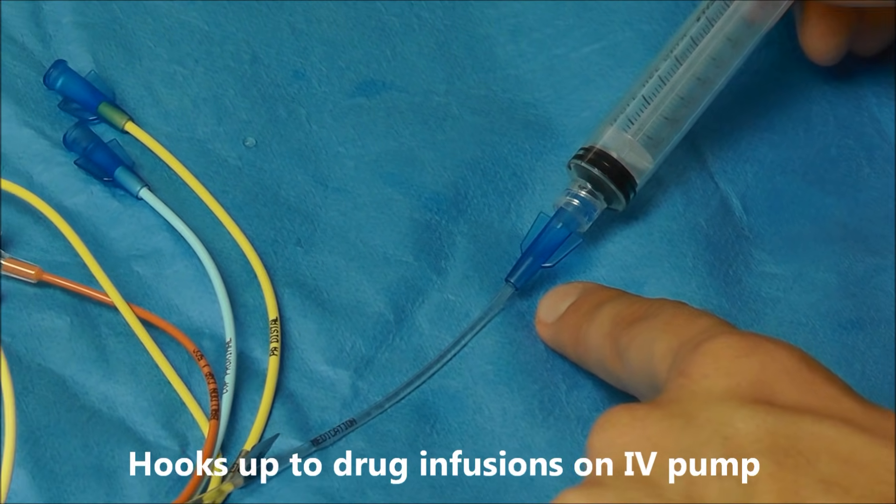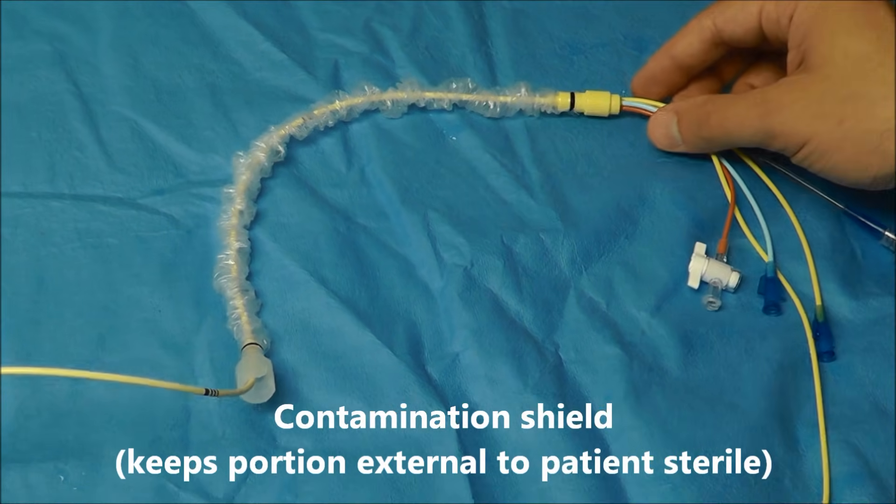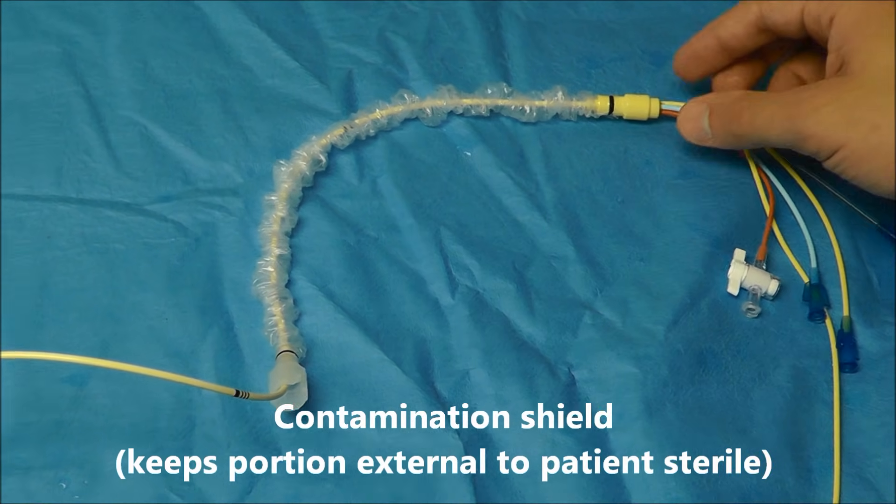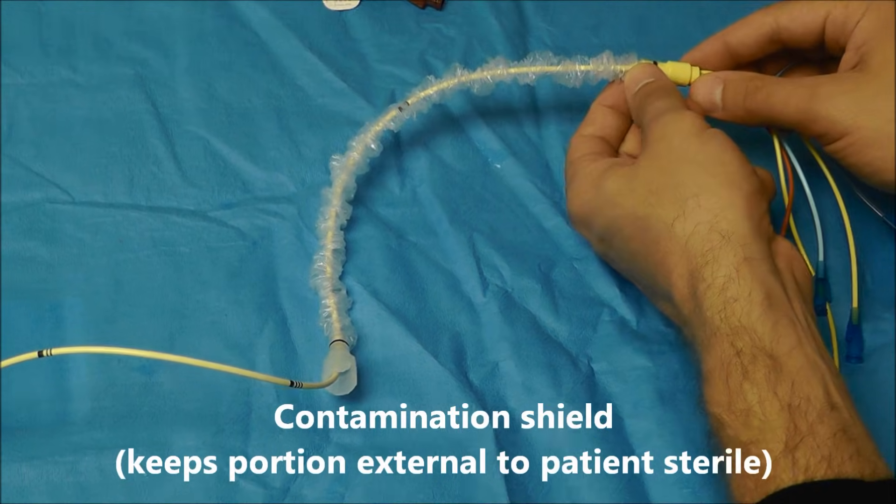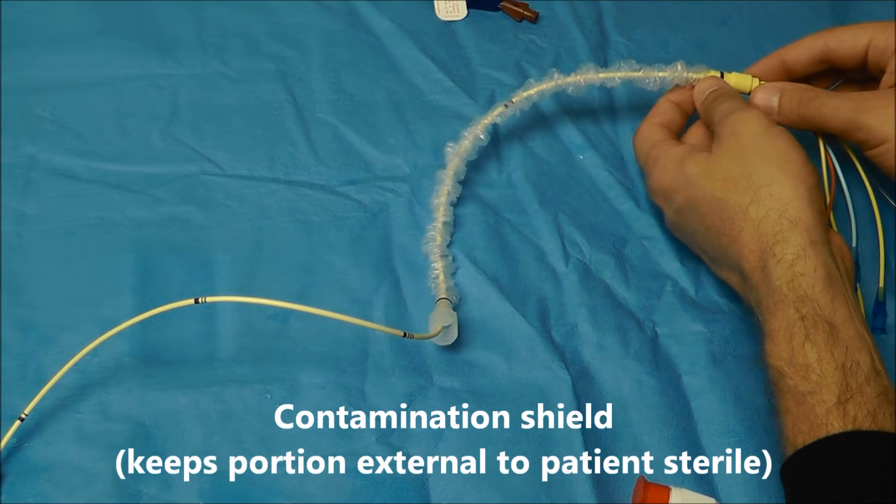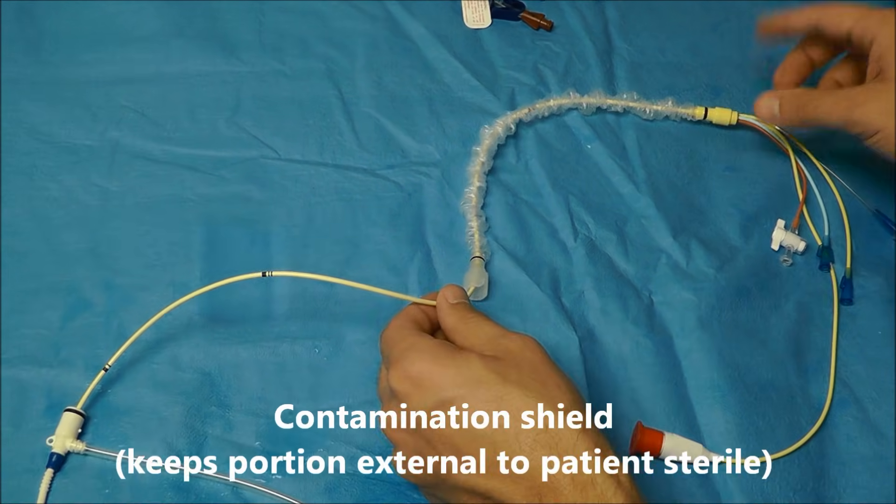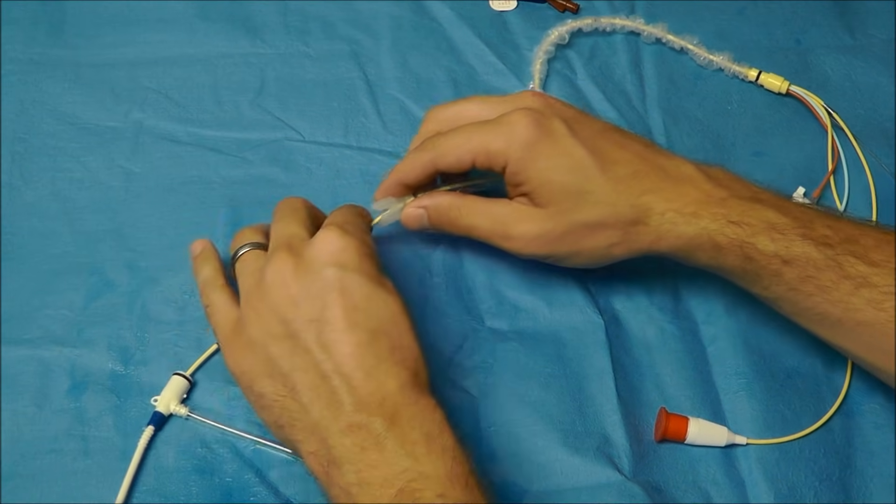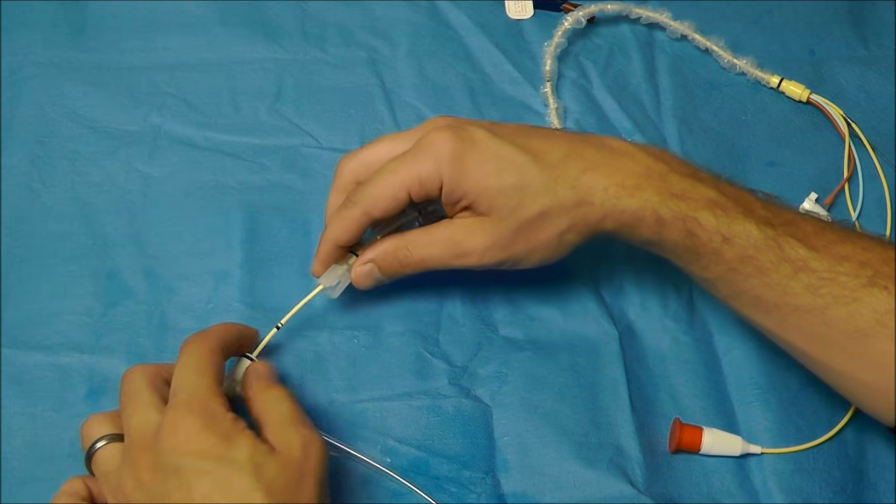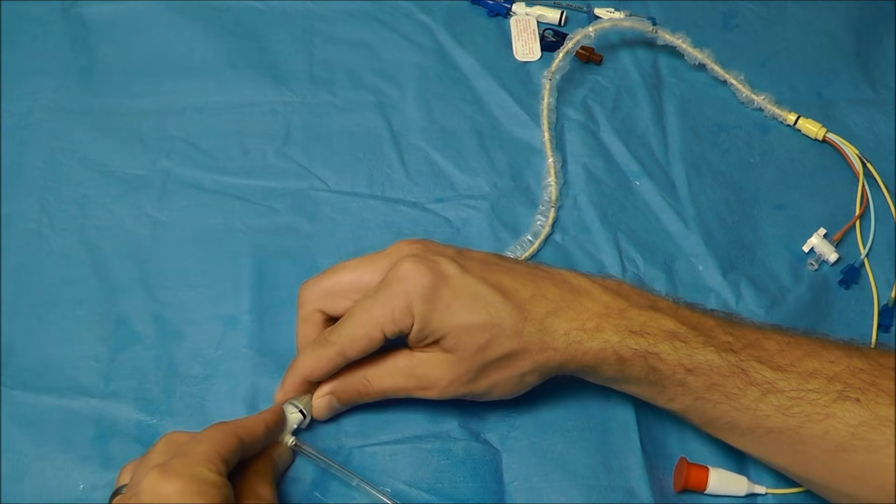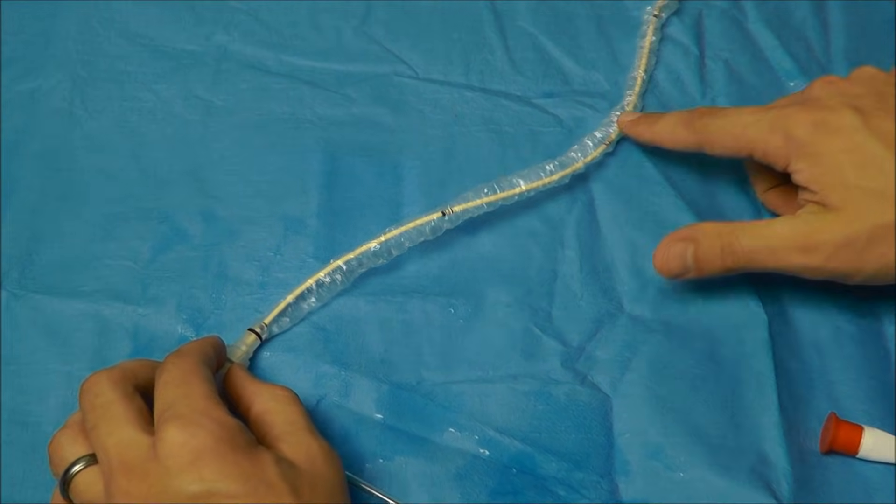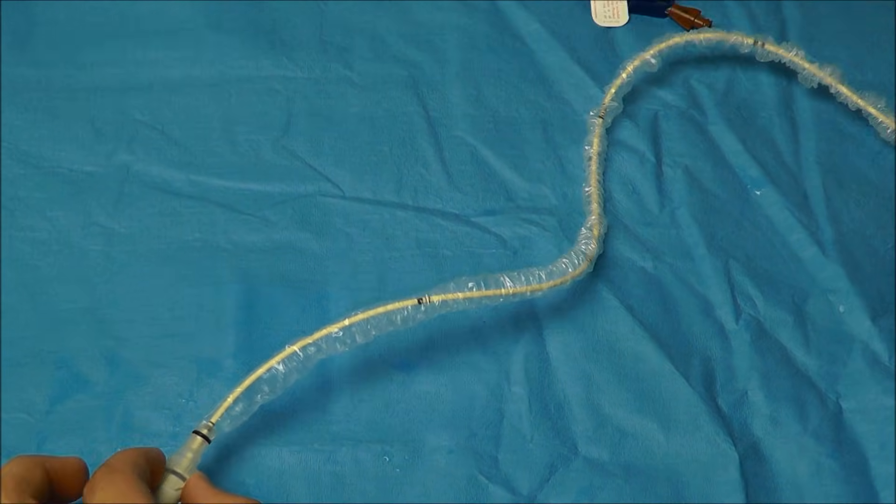The last thing that I want to cover on this pulmonary artery catheter is this sterile contamination shield here. And sometimes it's pre-built onto the Swan, but sometimes you actually have to put it on yourself. But basically once the Swan is in the right place, you bring this contamination shield all the way down to the hub of the cordis and attach. And that allows the portion of the pulmonary artery catheter that is hanging outside of the patient to remain sterile.